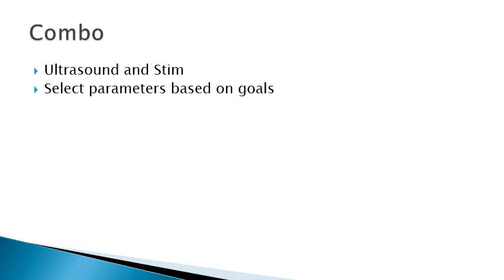So I briefly talked about combo a little bit in class, and again, this is the combination of ultrasound and stim, where you're actually using the ultrasound head to transmit both ultrasound energy and electrical stimulation. The key with this is just select your parameters based on your treatment goals. The biggest thing with the stim is, are you using it for motor purposes or for sensory? And you would basically set your parameters based on that.